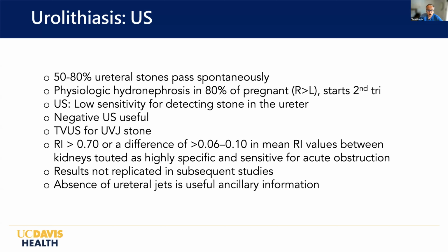So one caveat: knowing that physiologic hydronephrosis starts in the second trimester, if you do an ultrasound in a patient in the first trimester who has symptoms of renal colic or painful hydronephrosis, and there's hydronephrosis, then this is not going to be physiologic hydronephrosis because they're in the first trimester. And then there's a high suspicion for stone disease in that patient.